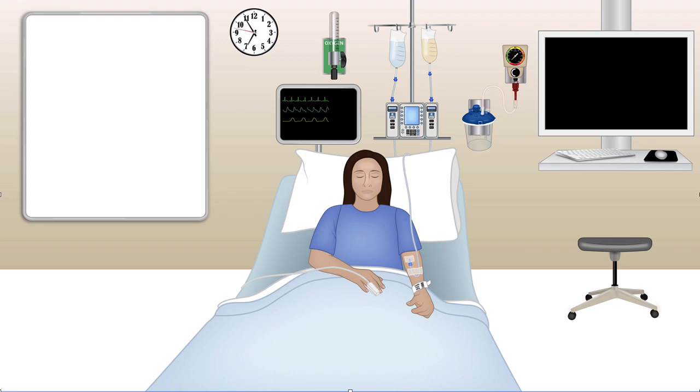What precautions should we take before doing an ERCP? So what are the precautions? And let us go through some checklists. If it's a woman of childbearing age, we should check a pregnancy test. It's very important to do that. Exposure with radiation to a pregnant woman is bad news. We should also check whether the patient is allergic to either iodine dye or contrast. And if the history is there, they should be prepared. And these patients can be prepared with steroids, Benadryl, Pepsid, etc.